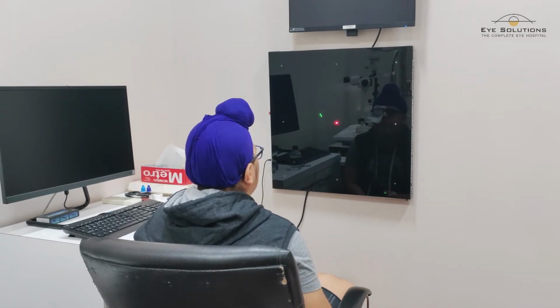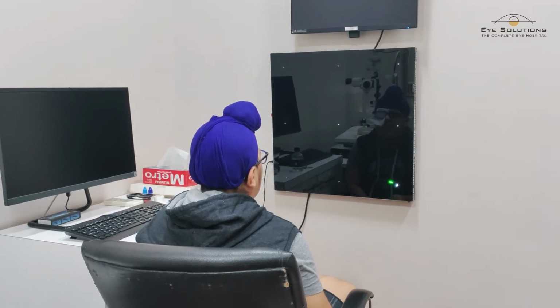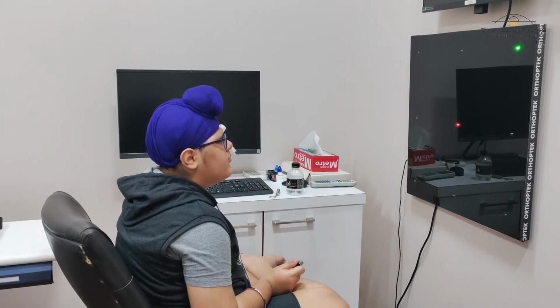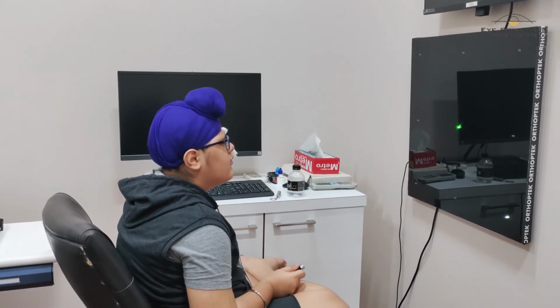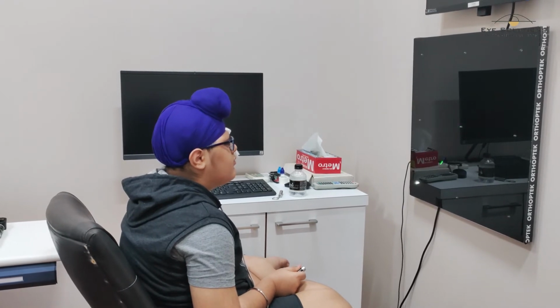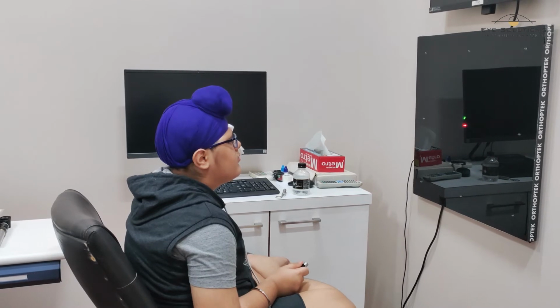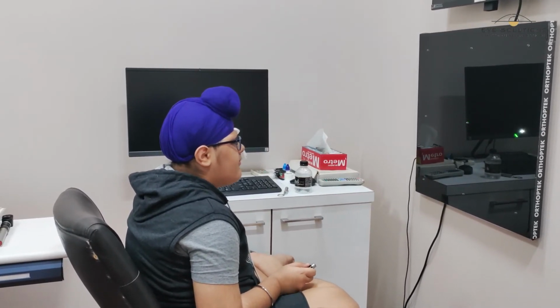The patient starts with the better eye while the weaker eye is covered, and he performs the exercise for 2 minutes. After that, the patient covers the better eye and performs the exercise with the weaker eye for about 20 minutes. After that, both eyes are open and the exercise is performed for 5 minutes. This concludes the first part of the exercise.